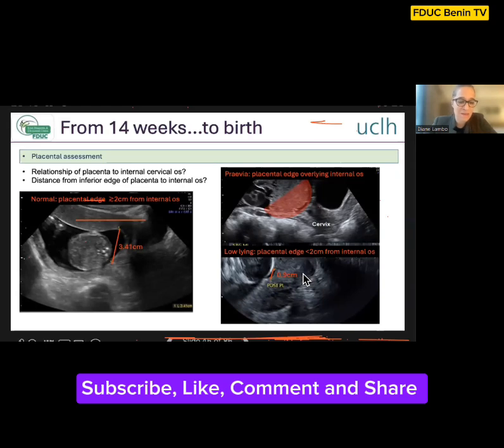I mentioned earlier that there are some cases we use transvaginal ultrasound. This is probably it. When you have a posterior placenta and you think it's low, I would always encourage you to do a transvaginal ultrasound to be able to interrogate that a little bit more closely, because it can be exceptionally difficult with a transabdominal probe.